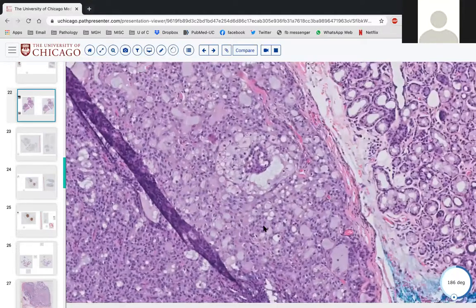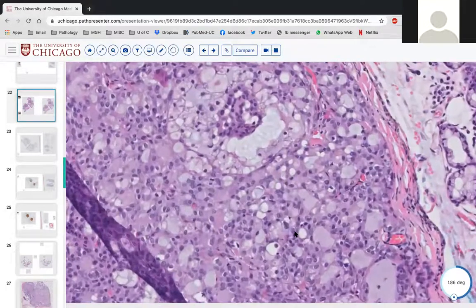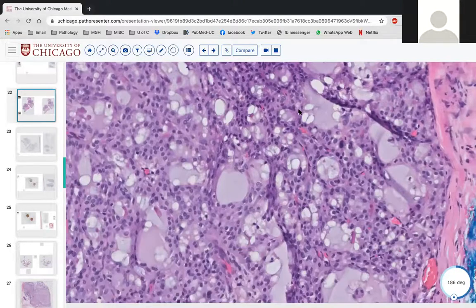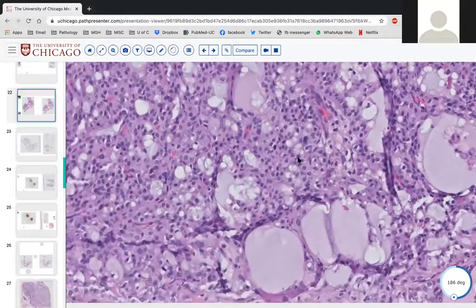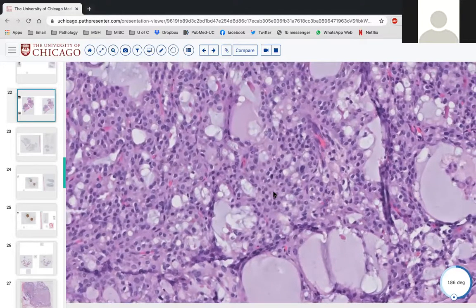What would you be expecting? Sorry, go ahead, Luke. I was going to say, I agree with the microcystic pattern, and could it be an acinic cell carcinoma, which can have a microcystic pattern? That is something I would add to the differential. Yep, Heather mentioned that too in the chat. So Magna, would you want any stains? Yeah, sure. Maybe we can do a C-kit and a P40.